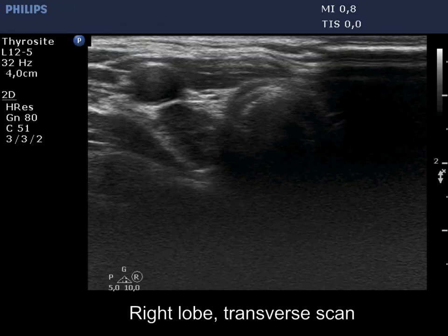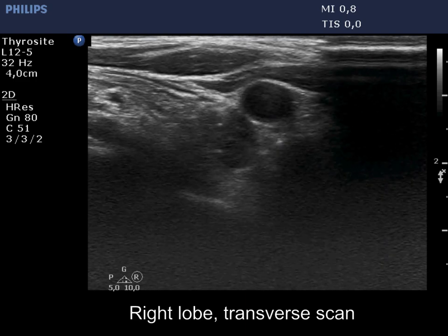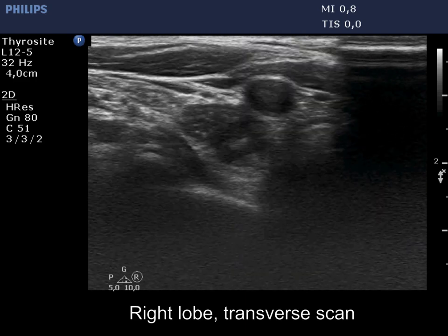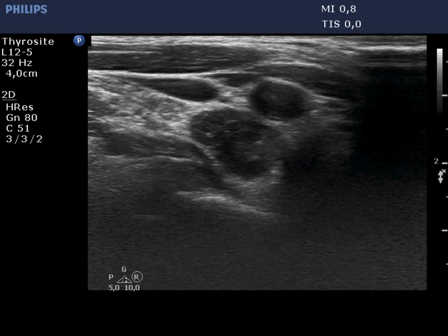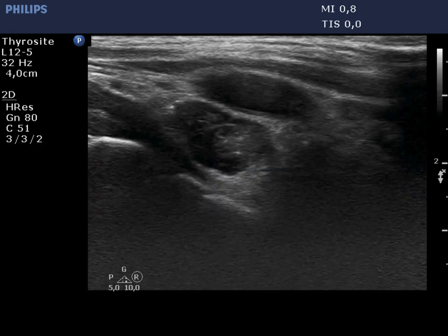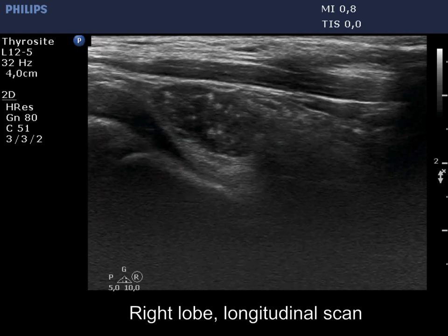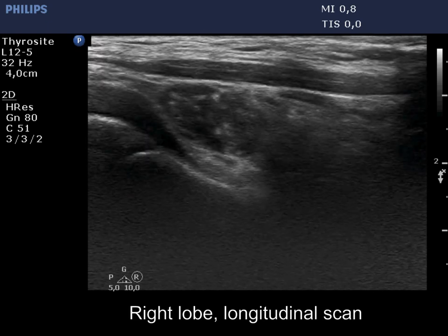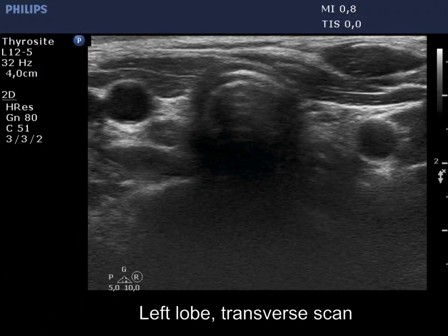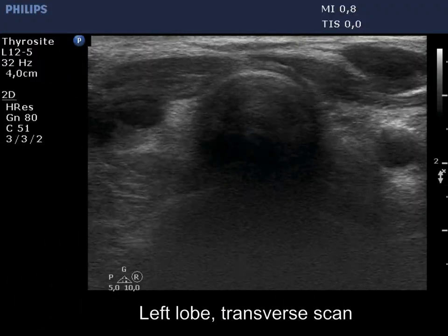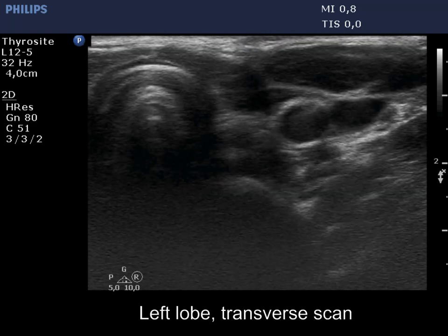The right bed is filled with muscle fiber and connective tissue. There is a large hypoechoic mass in the lower part of the left thyroid bed or below it. The mass has various intranodular echogenic figures including microcalcifications and presents cystic areas as well. The tiny hypoechoic areas within connective tissue have no relevance.